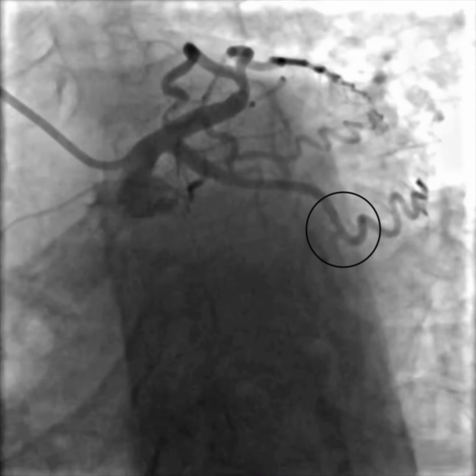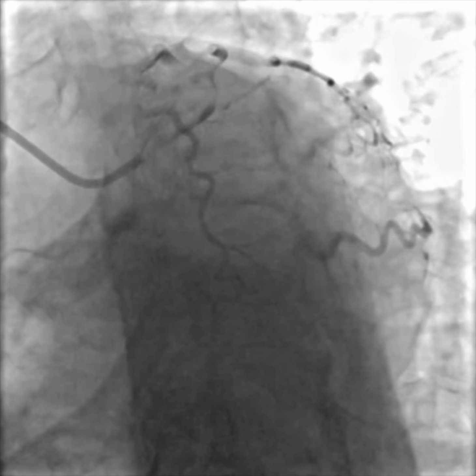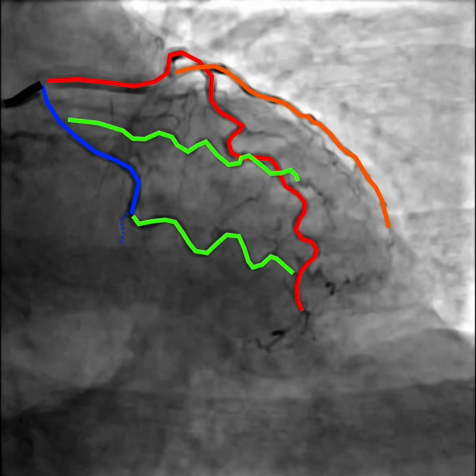Now, to be clear, even for an experienced angiographer, this would be really easy to overlook if you were not careful. I sent this to a couple friends that are better than I am at angiography and even told them there was an acute culprit, and they still had a lot of trouble finding this. Extremely easy to overlook. Even on the cranial-caudal view, which should be the most obvious view for spotting the circumflex and its branch vessels, it's still hard to see.